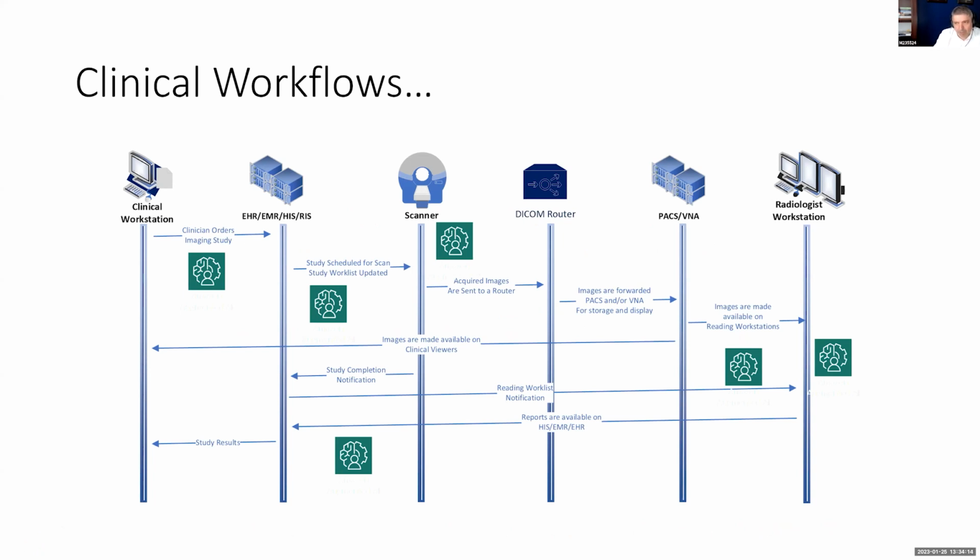So if we were to assume a traditional clinical workflow, it would start with an order from an ordering physician for an imaging study, and that would create what we call an order for an exam. Let's say you have questions about a lung cancer patient and you're ordering a CT exam. That would create what we call an order in the system. And that order will be recorded in the EHR, EMR to be acted on.